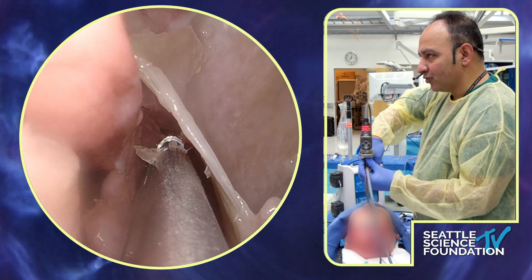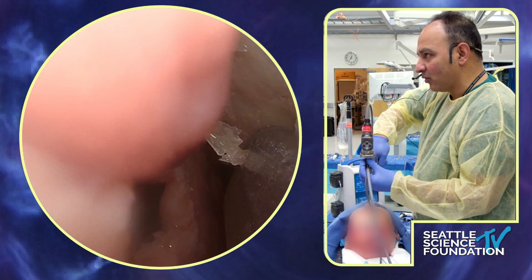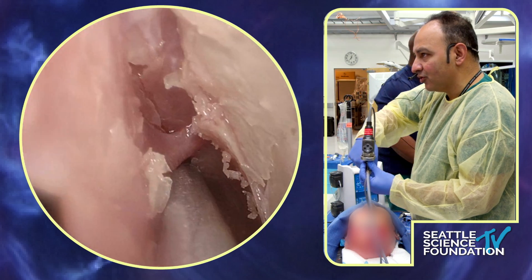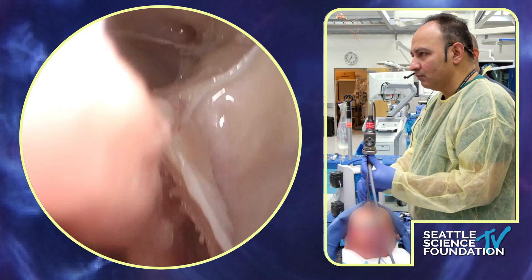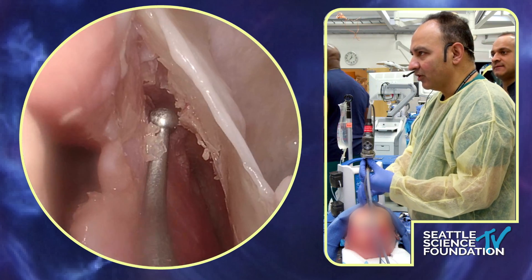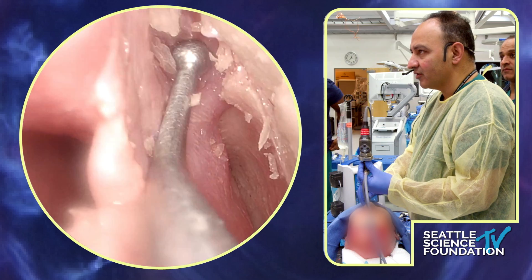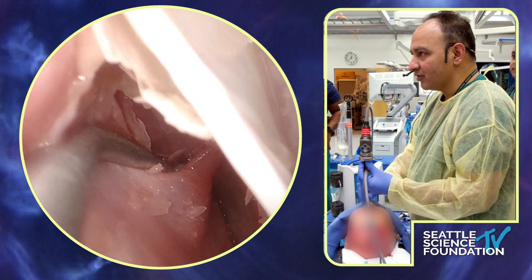This is the same sort of approach we'll do for the sphenopalatine artery for JNA. You could just take the whole back wall off if you want to. But here we can see the artery — you can see it doesn't tear very easily; it has a pretty good robust nature to it. We'll now take all this off to really show you where the artery goes. Let's get a little more isolated here and dissect it circumferentially — I'm hoping to get all the way around without tearing it.